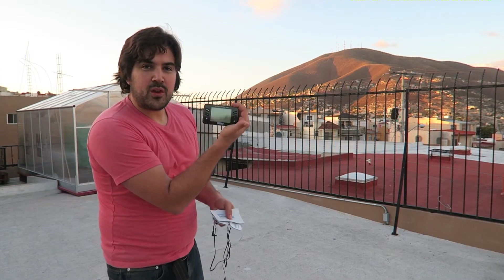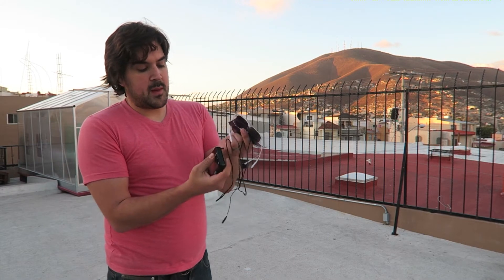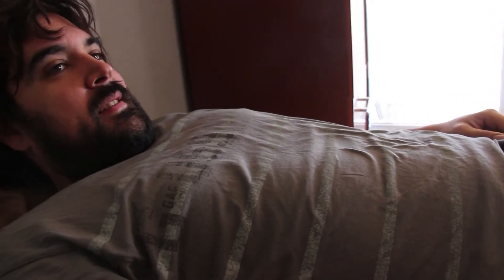Quick rundown of the little machine: there's a little control unit, or a brain if you will. There are these little cables that get plugged into the little brain, and then you have these little pads that are sticky on one side. You put them over the area that is in pain, hook it up, and then run the program — and you'll feel the twitches.